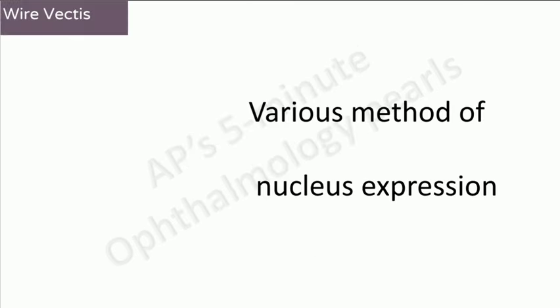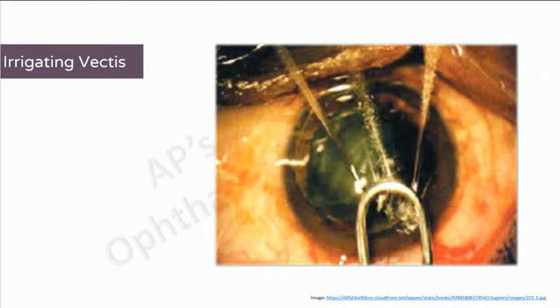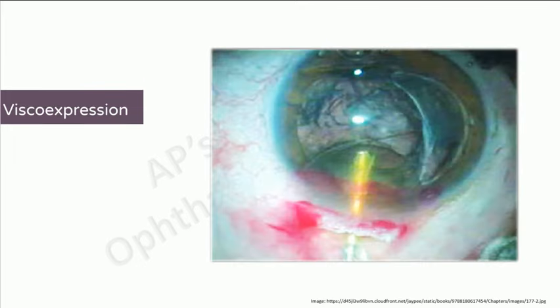The wire vectis is only one of various ways to remove the nucleus in SICS. We shall see some of the others. Here the vectis has a provision for continuous infusion of BSS to increase the pressure in the anterior chamber and to help push out the nucleus.